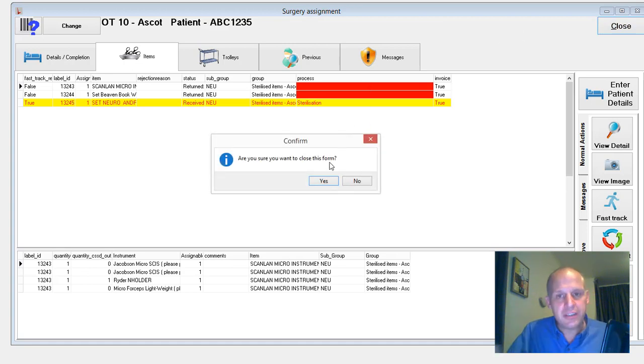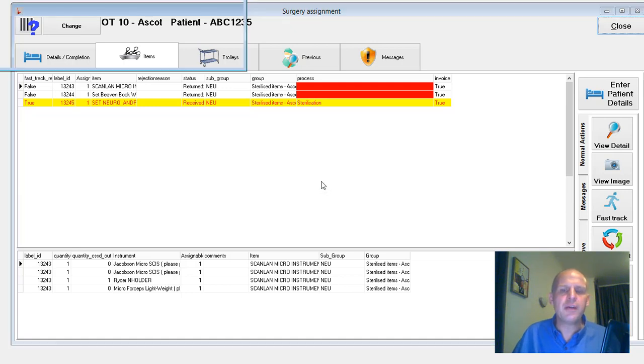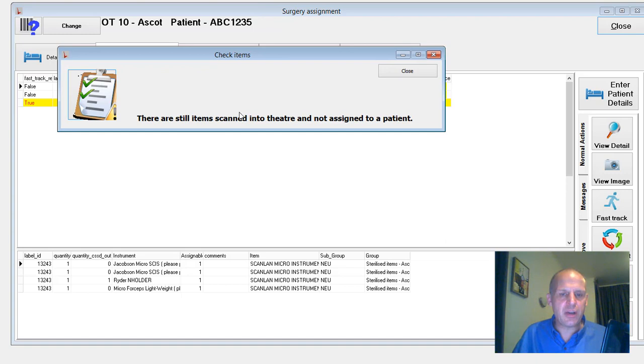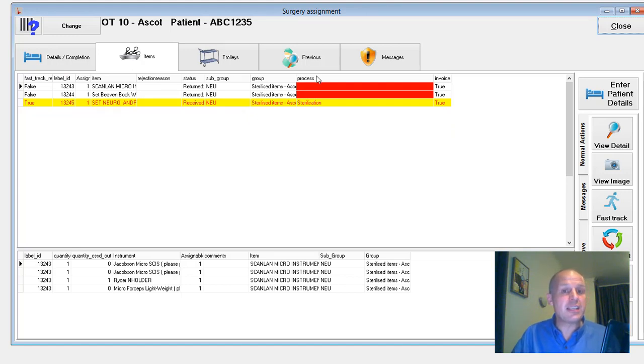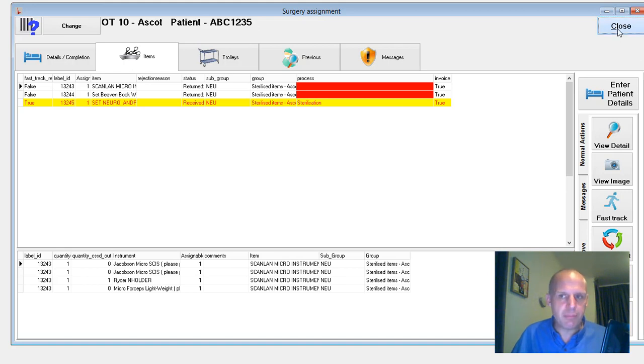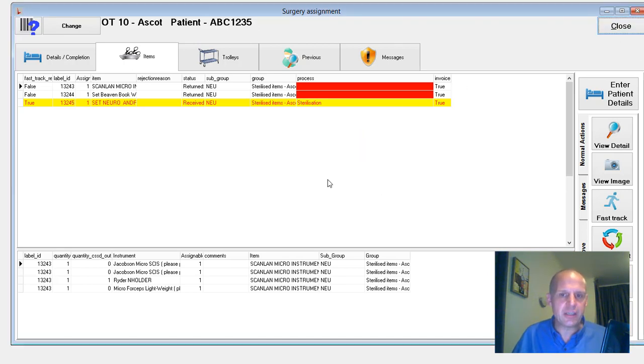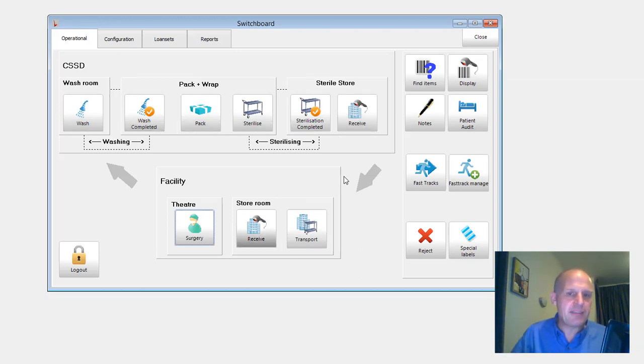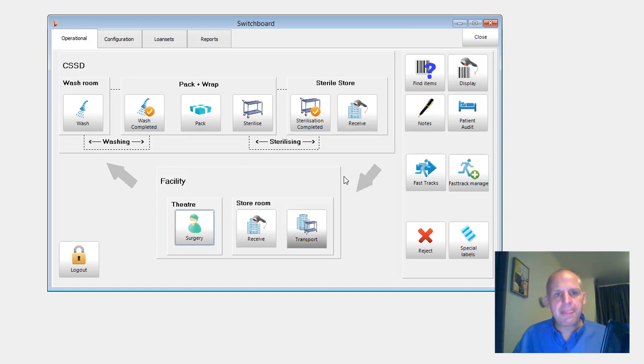So I'm going to close that and move. Oh, no. So this is one change that has happened. Are you sure you want to close this form? Now it's going to give me a NAG screen. There's still items scanned into theater and not assigned to a patient. So I'm giving you a warning. If I was to try and quit Ultrace, I'd get that warning. And then what I have to do is then repeat the process again and say, yes, I actually do want to close this form. And so that's how we're trying to stop items being left scanned to a procedure, but not actually assigned to a patient. So minor change, but makes life easier.